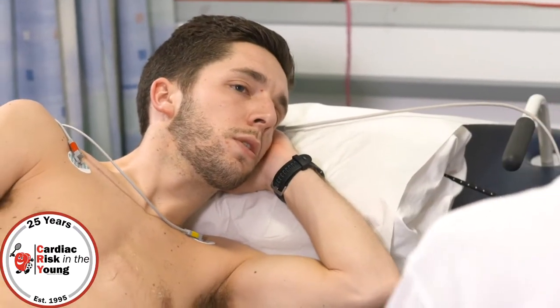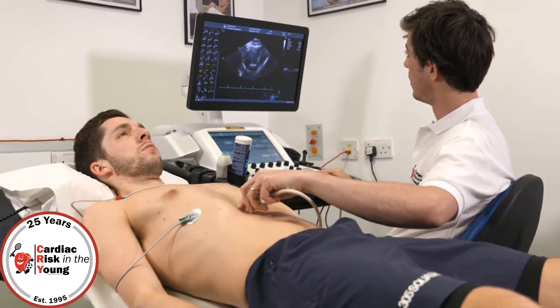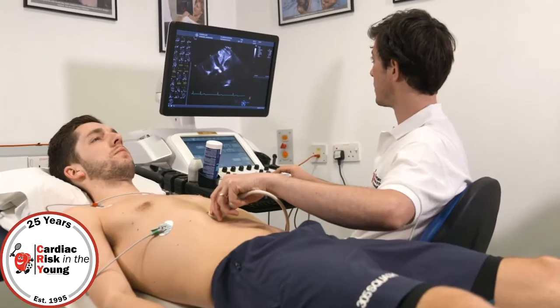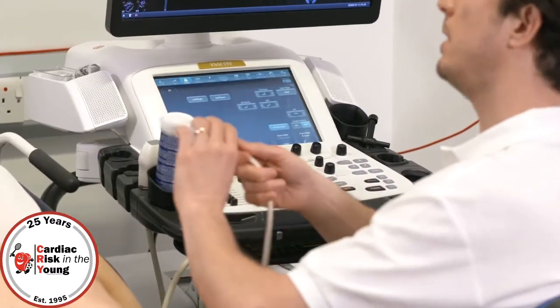I'll get you to lay flat on your back so you're facing the ceiling. And deep breath in, hold your breath out, and breathe normally. Now I'm going to ask you to sniff — sniff in. Chin up please, lift your chin.